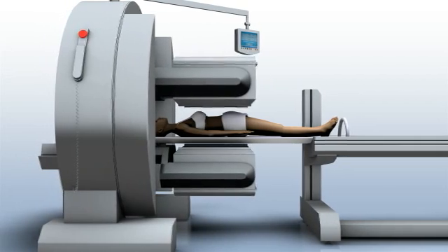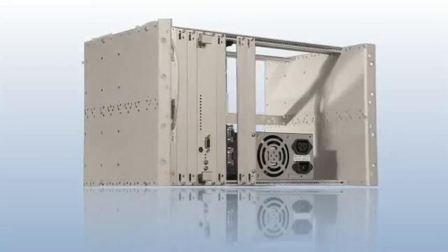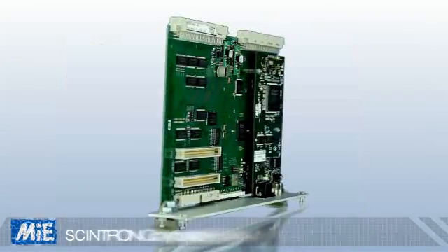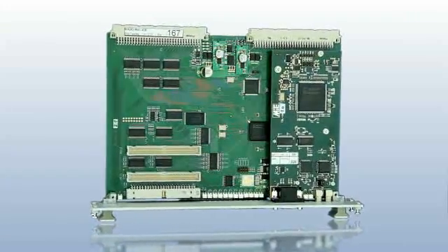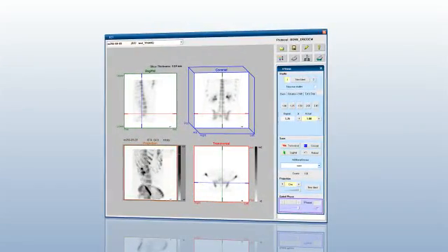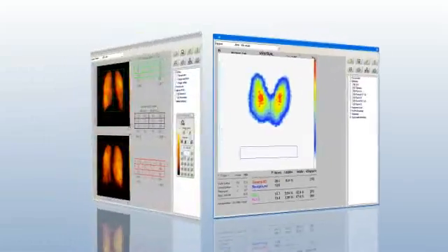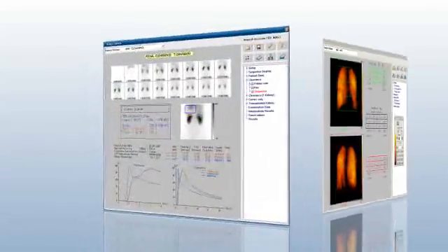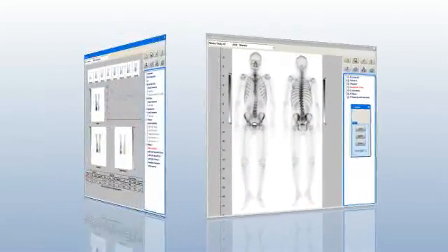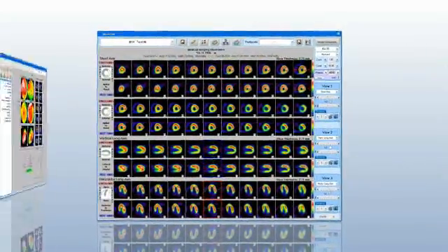The image information from the detectors is processed in the Syntron system, designed by MIE. Schematics, PCB layouts, source codes, and graphical user interfaces are developed in accordance with the functional specifications. With the aid of these developments, the Syntron computer system controls the acquisition, analysis, and processing of the image data. The entire examination spectrum can be conducted with the extensive software package, which is designed for nuclear medicine requirements and ensures intuitive operation after the first briefing.